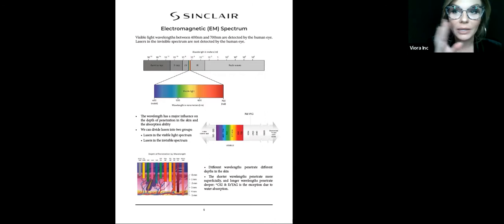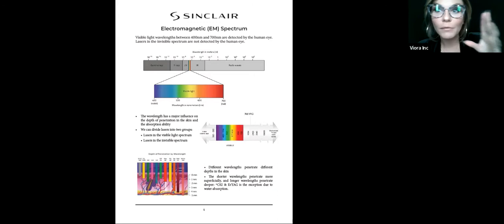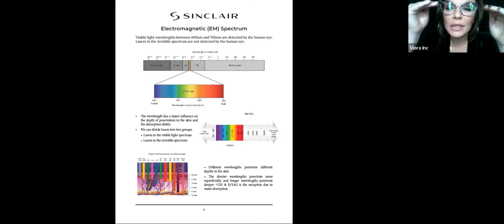But with the diode laser, we're going to talk about what wavelengths we are using. It's outside of the visible spectrum. It's a little bit deeper into the infrared spectrum. With lasers, the shorter the wavelength, the lower the number, the more superficial it's penetrating in the skin. So when you hear a number like 415 nanometers, that's very superficial in the skin compared to, let's say, 1064 nanometers. There's a big difference in those numbers. Therefore, there's a big difference in how deep it's penetrating into the tissue.